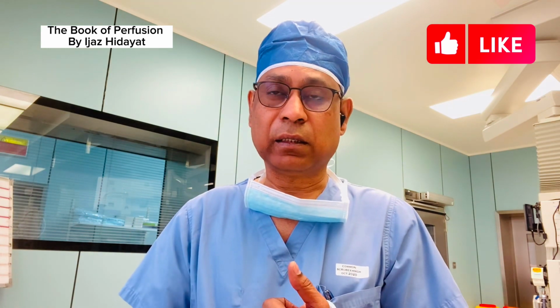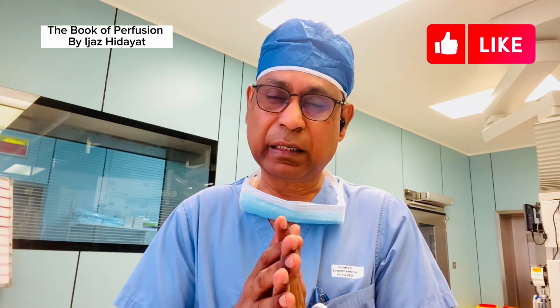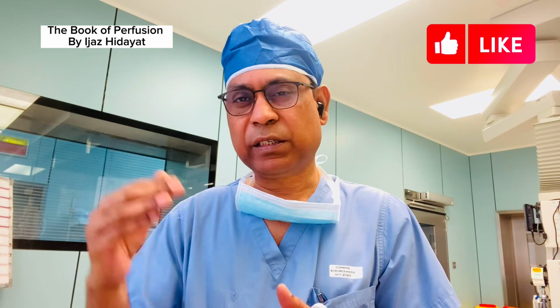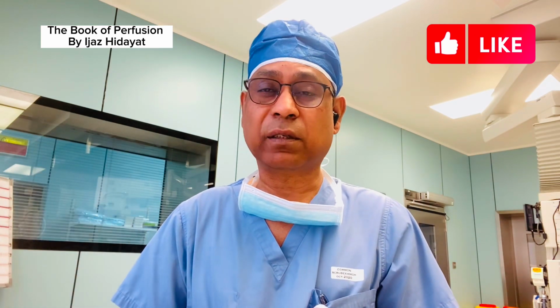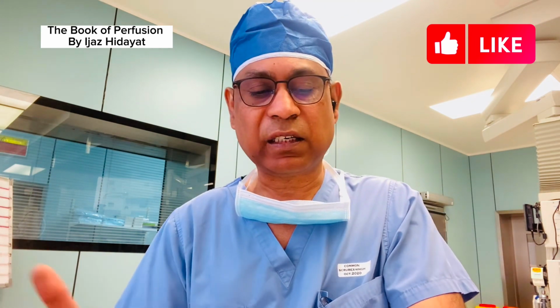during the beating of the heart, the heart is not fully decompressed, so there will be small ejections there. So we always request the anesthetist to keep the ventilation going from the ventilation side.